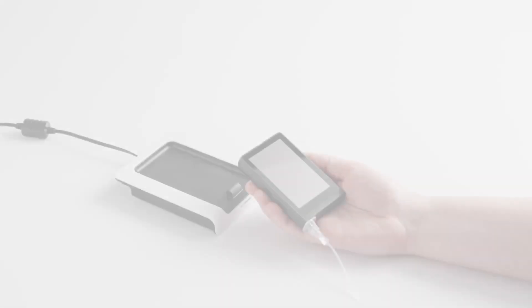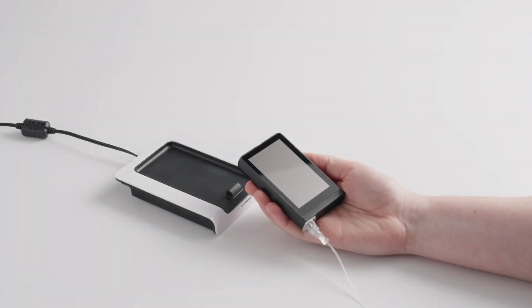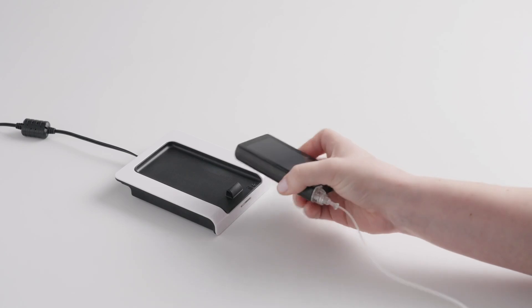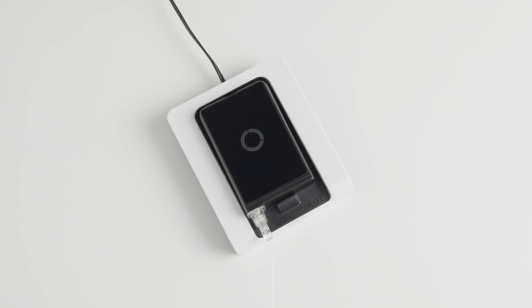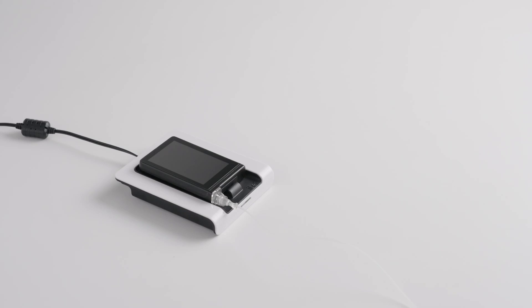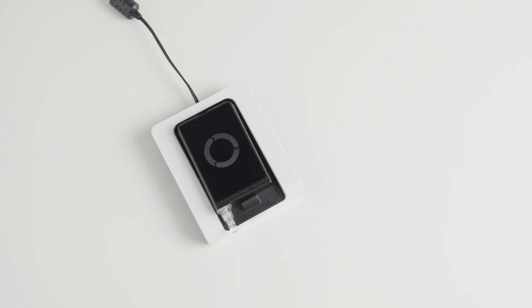If the iSlet is powered off, you can only turn it back on by placing it on the Beta Bionics wireless charging pad. The iSlet will take a few seconds to power on. The Beta Bionics circle will appear and the backlight will illuminate the screen. When the iSlet is powered on, it will beep and vibrate, indicating that it is charging successfully.